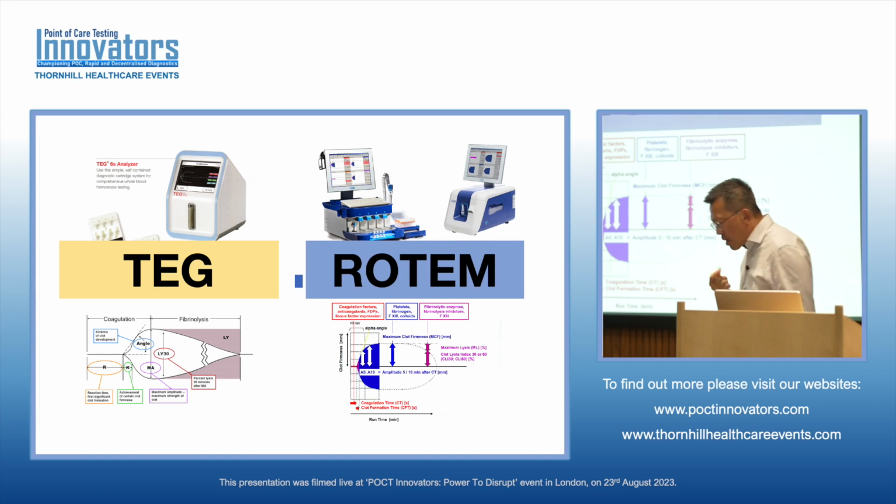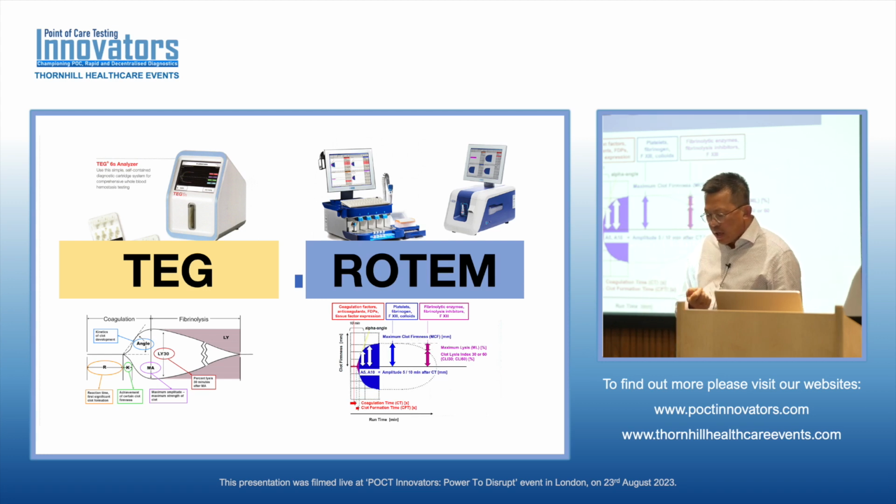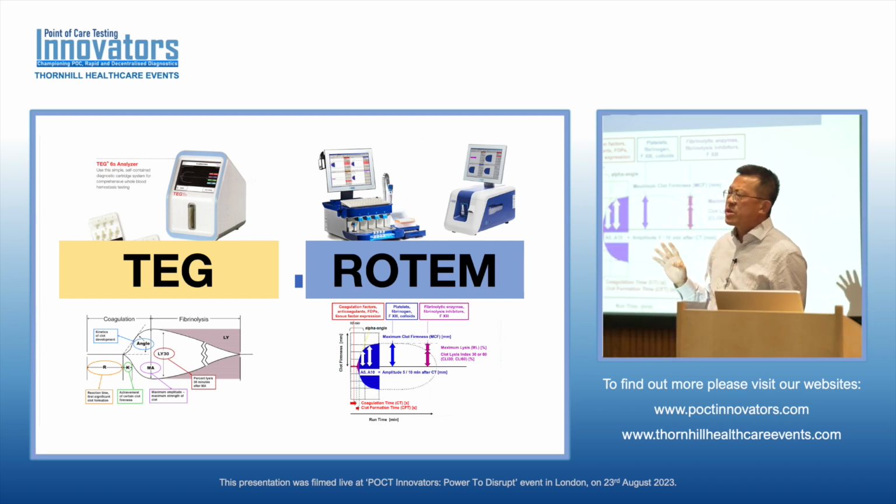So, as I said to you, I work quite closely with the lead biomedical scientist in transfusion, Julie Cole, and we've talked about this for many years now, and they have, I think, three Sigma devices now in the lab. If we could prevent any clinician from ordering any blood product apart from red cells without a ROTEM being done first, we would save so much misuse and inappropriate use of blood products.